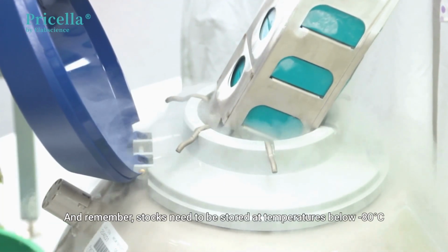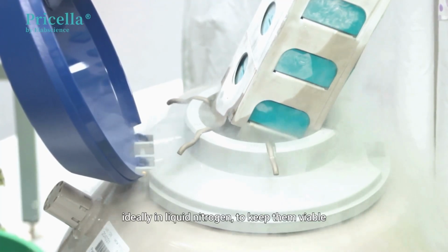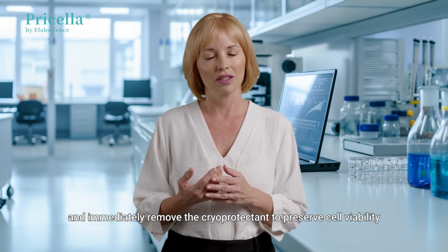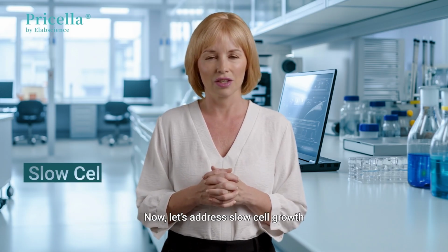And remember, stocks need to be stored at temperatures below minus 80 degrees Celsius, ideally in liquid nitrogen, to keep them viable. When thawing your cells, it's crucial to do so rapidly and immediately remove the cryoprotectant to preserve cell viability.